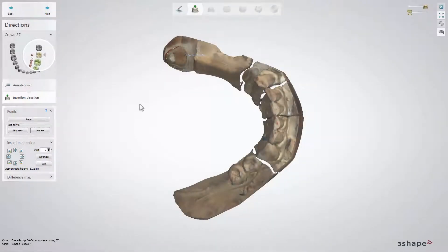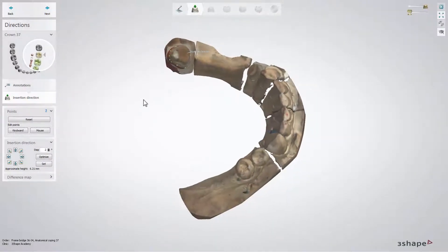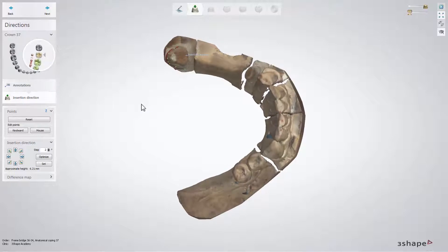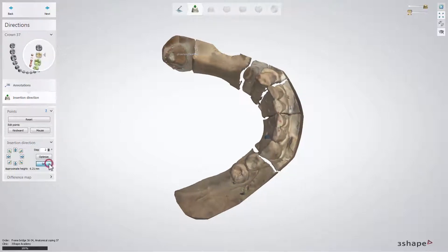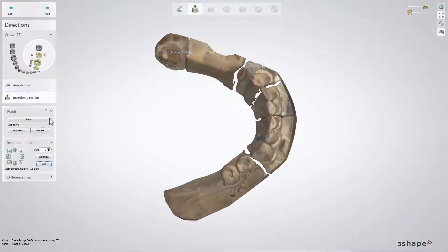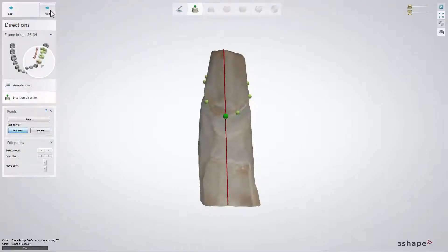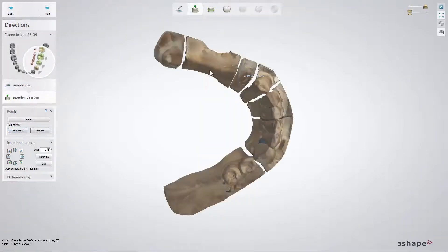At this step, the software will calculate two different insertion directions for both parts of the split bridge. Please define it for the first part of the bridge, then press Next and start doing the same for the second part.